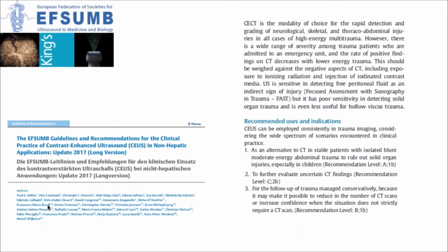There is an acknowledgement that contrast-enhanced CT is hard to beat as an emergency modality. And again, we are talking about the polytrauma unstable patient. However, that makes up a small minority of the volume of total traumas. Realistically, what you see more often is small volume trauma, possibly single organ trauma, and there is a need to exclude rather than include an injury.